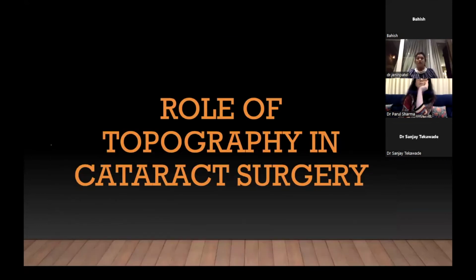Okay, so before we start the role of topography in cataract, do we have any questions for refractive? There is one question, Jenin: do we check the tangential curvature map for LASIK, or is the axial curvature map sufficient? For what? For LASIK, for looking at the cornea.